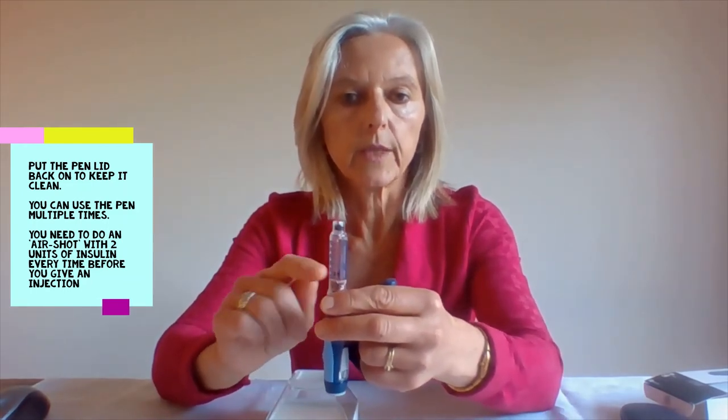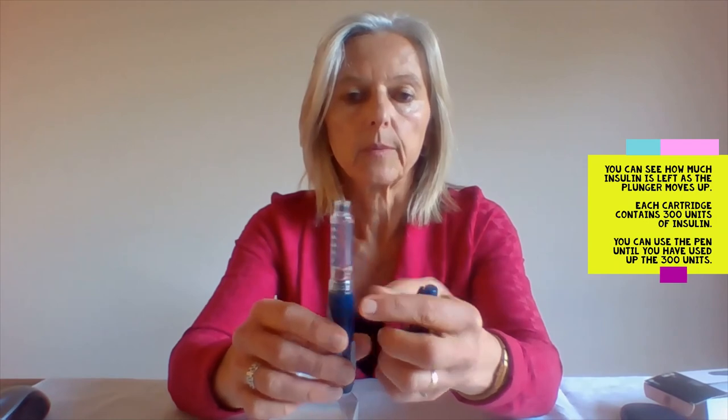You then close the lid to keep it nice and clean. You can now use it again next time — and again, do the two unit air shot each time before you dial up your actual dose. You can see how much insulin is left via the plunger, which will move up as you use up the insulin. The cartridge contains 300 units so you can use it multiple times.